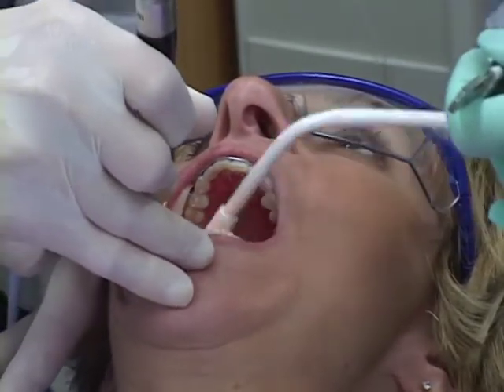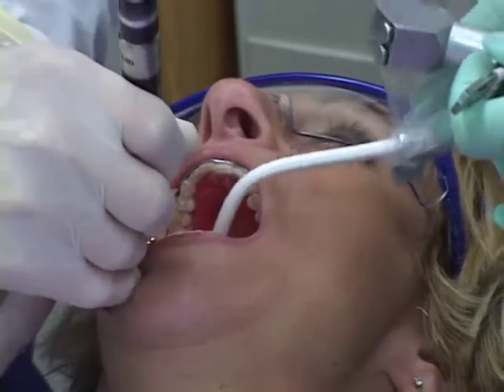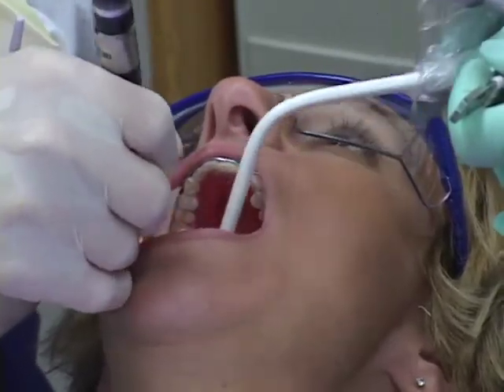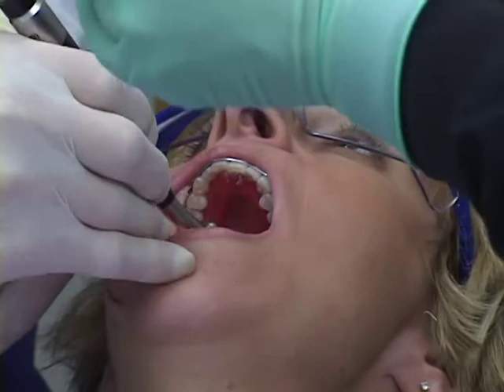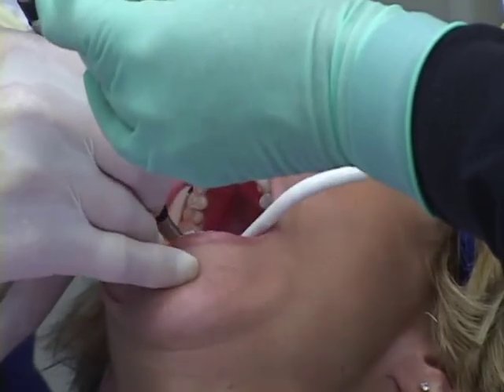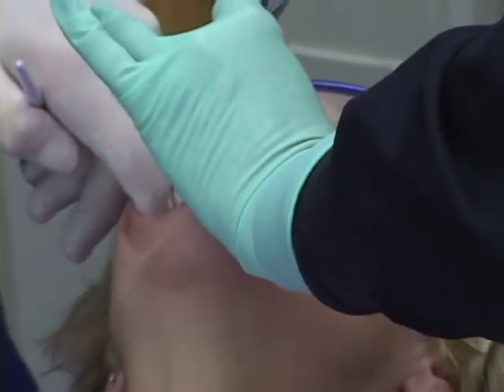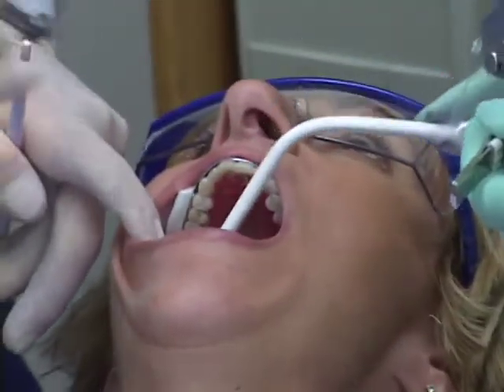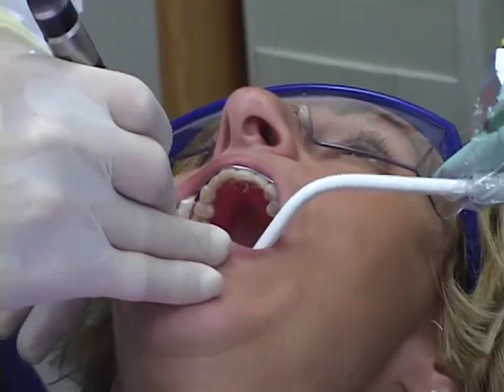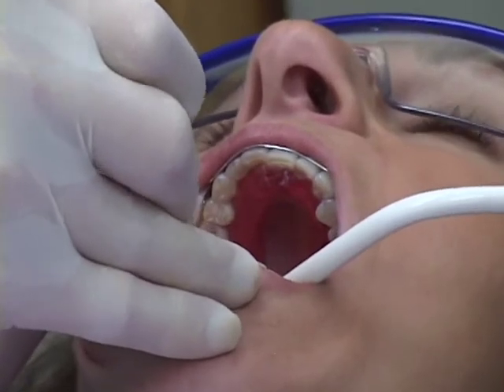And as far as whether I adjust lower or upper cusps or upper teeth, it really depends on a number of factors. Ultimately, one where you're going to have the best idealized distribution of forces along the long axis, but also if there are restorative considerations. For example, if one tooth is going to be restored with a crown or full coverage restoration, obviously we're going to try to do the majority of the adjustment on that particular tooth.